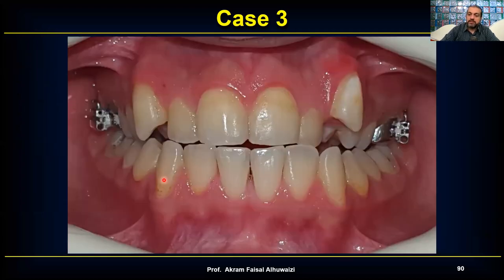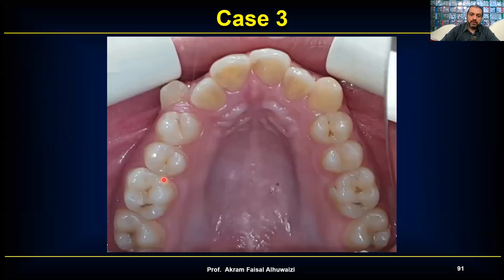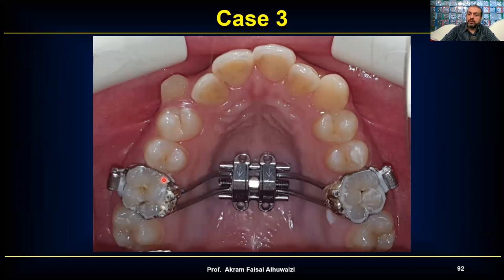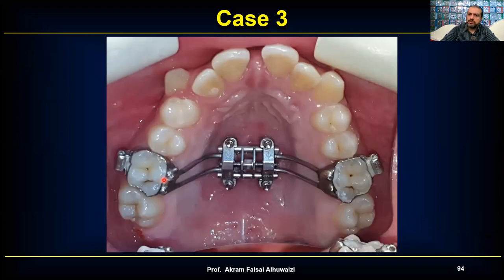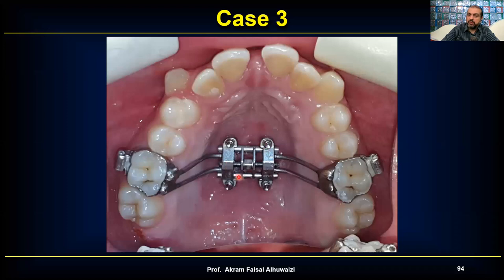I cemented the appliance in the patient's mouth, inserted the screws, and two weeks later the patient returned — the suture had opened. My second successful case! At that time I was still using a more anterior approach, reluctant about going posteriorly after my first failure. Later I became more comfortable pushing the MSE further posteriorly for more mid-facial rather than just lower alveolar expansion.